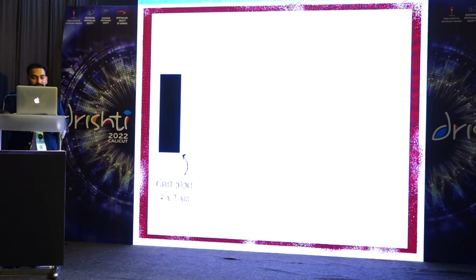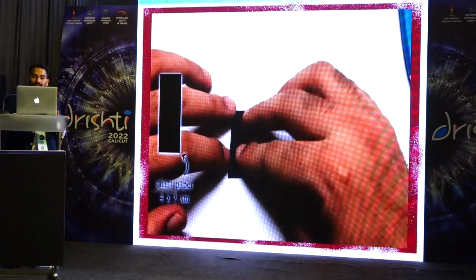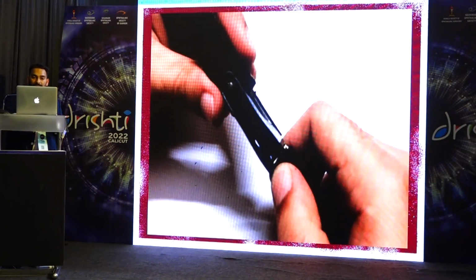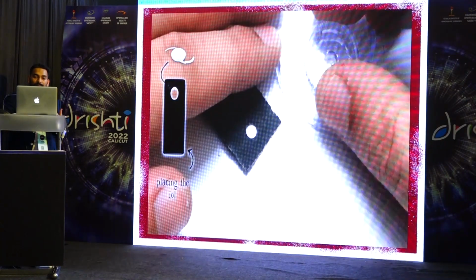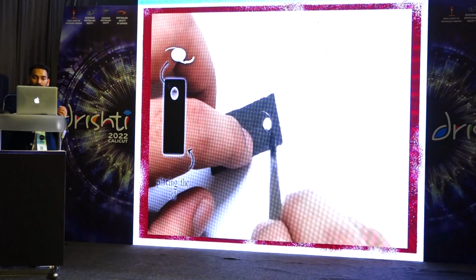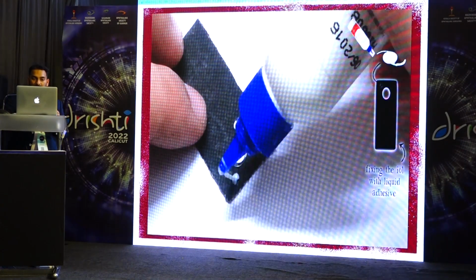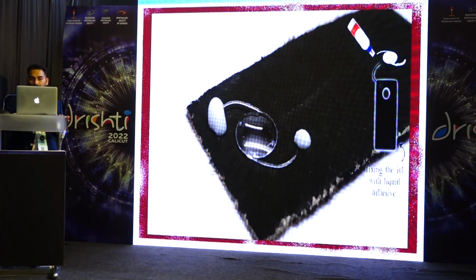Here is the way we prepare it, using a chart paper again. Punch it with the puncher to make a small hole, and then you can use four 30 diopter lenses and paste them with just a liquid adhesive like Fevicol.